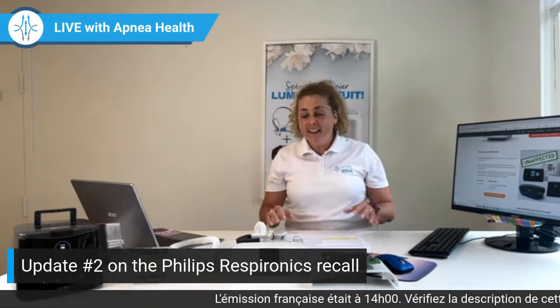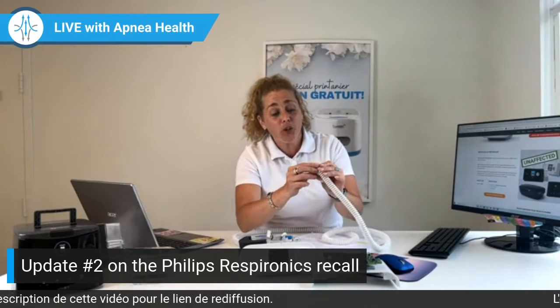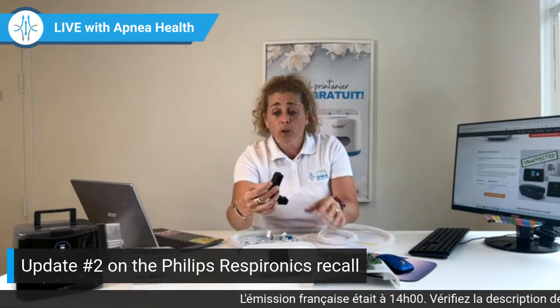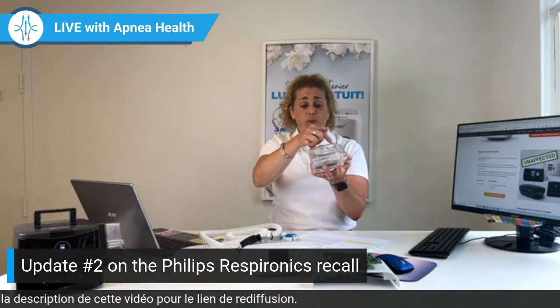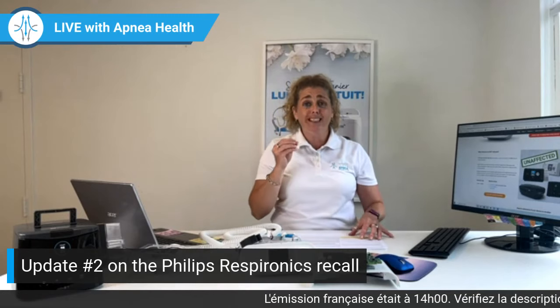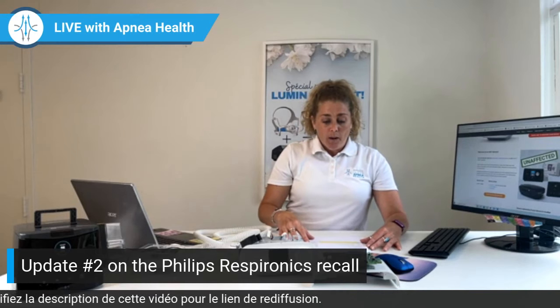Donc, I'm French and English. Donc, peut-être. So, first off, you need to check your tube. Inside your tube, and it's white. You can't miss it. White and black, so you can't miss it. Inside your tube, you would see little black particles that would be stuck inside your tube. And those particles are from the foam degrading. So you would see that in your tube. You would also see it in your water chamber, probably stuck in the water. Or also check your mask and your filters for those little black dusty particles that come from the degradation of the foam.